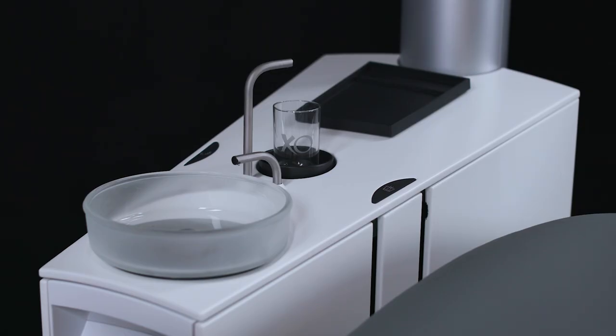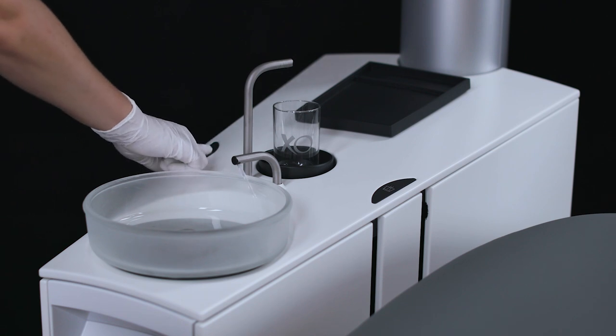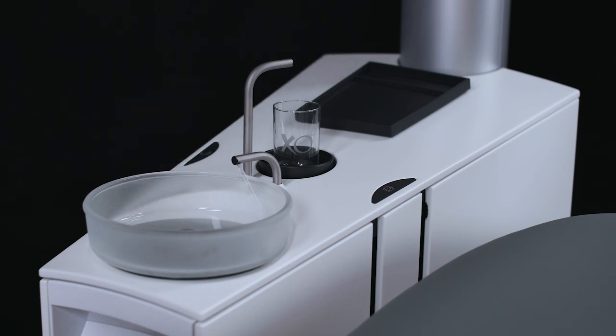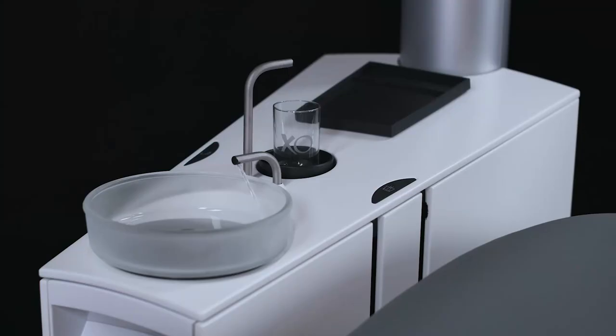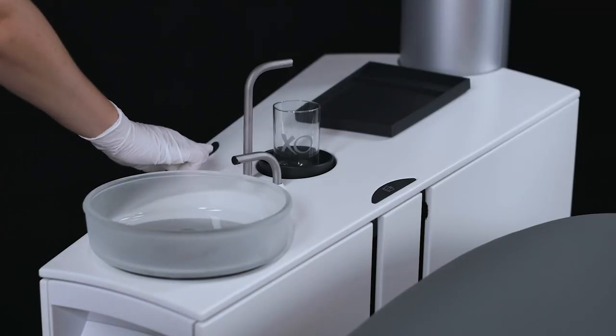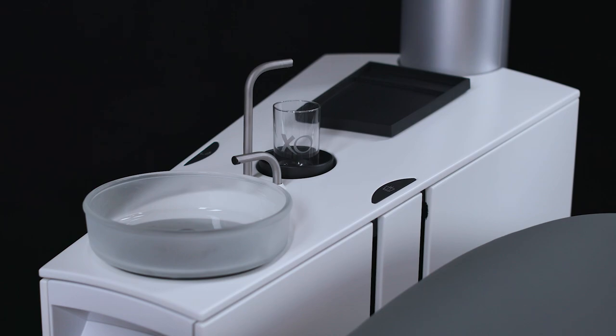Start the cuspidor flush manually with the button on the left side of the top cover. It will stop automatically after the preset rinsing time. Abort the cuspidor flush by pushing the same button while rinsing.